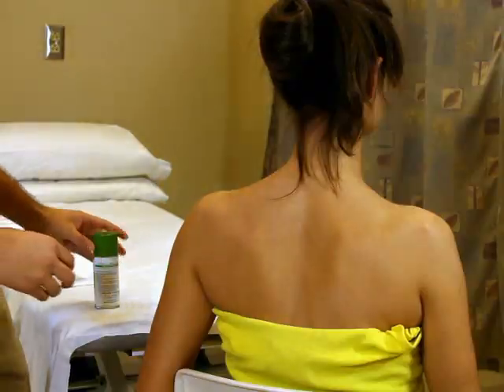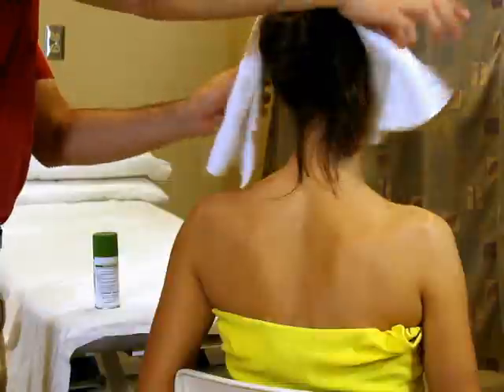Position the patient comfortably with the area to be treated exposed and accessible and cover the patient's eyes, nose, and mouth if spraying near the face to minimize inhalation of the spray.